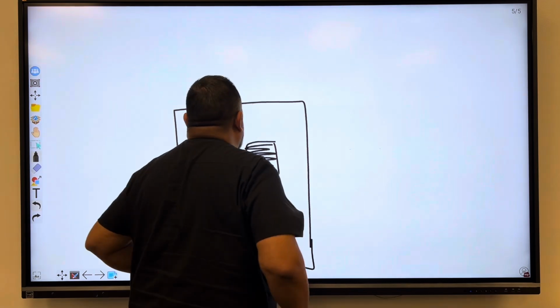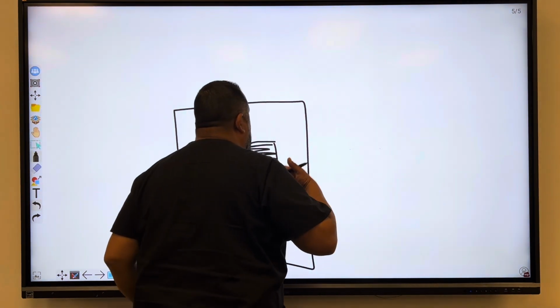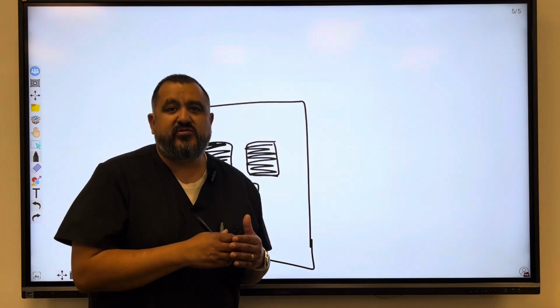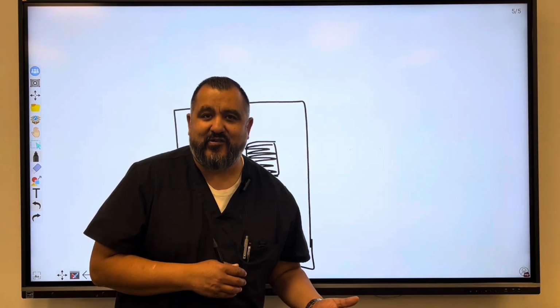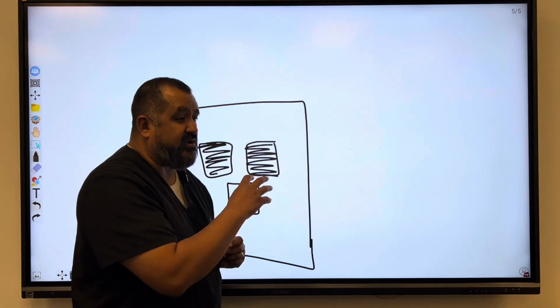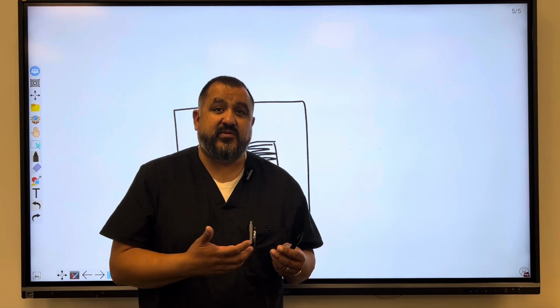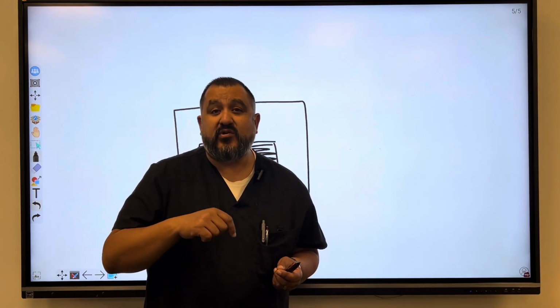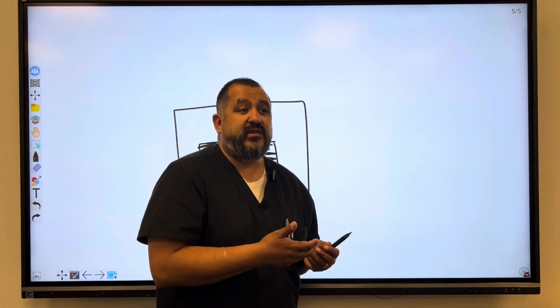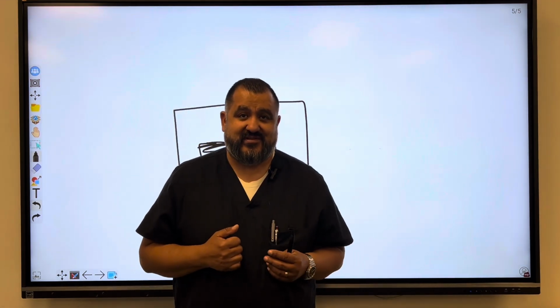Okay, so you would put my chest against the board, tell me to breathe, and x-ray it, and the exposure time is not going to show up until after you do the exam, okay? So sometimes the chambers are automatically selected, and sometimes you have to select them. It just depends on your system. Sometimes you can override them as well, but the chambers are going to be in the areas where you're putting the area of interest, all right?